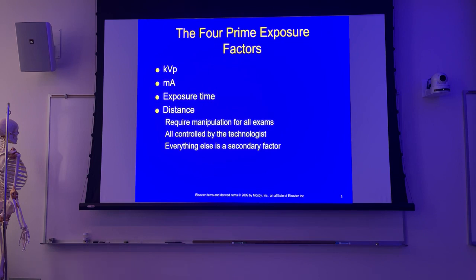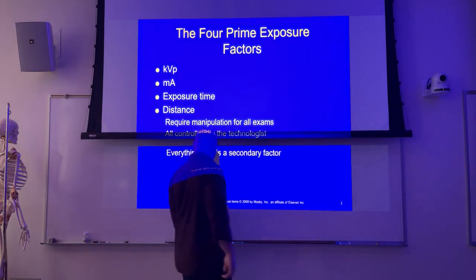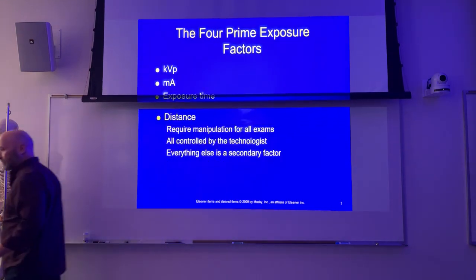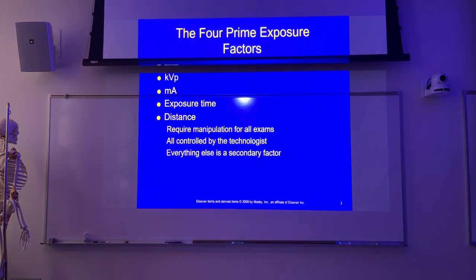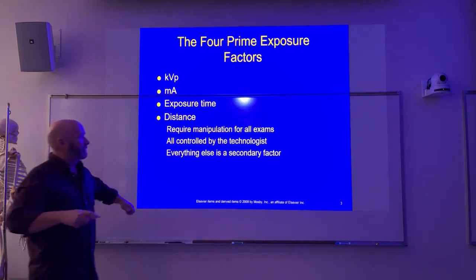What it's talking about there, I'll pull one of these up just real quick. What it's talking about there is specific to the voltage ripple. I need something besides blue. And I don't need a magic marker. So let's see if red shows up.